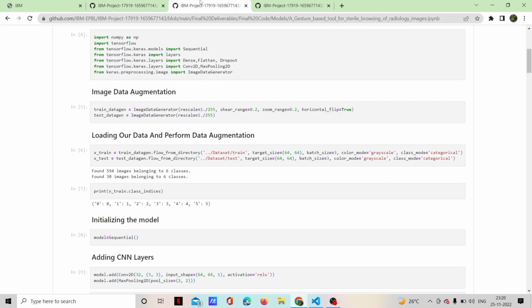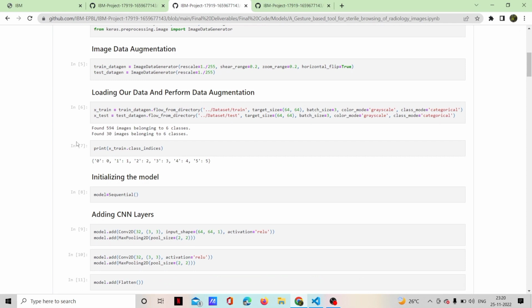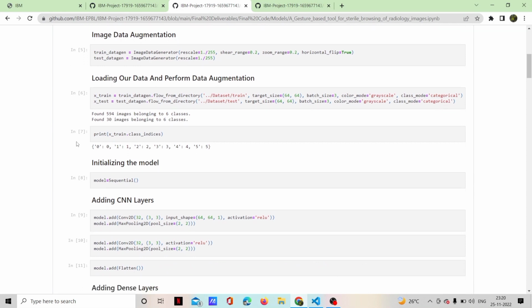Next is image pre-processing. Image pre-processing is done to format the images for color correction, which is for training the model for a better accuracy. So the image data generator library is imported and then the data is loaded for data augmentation.